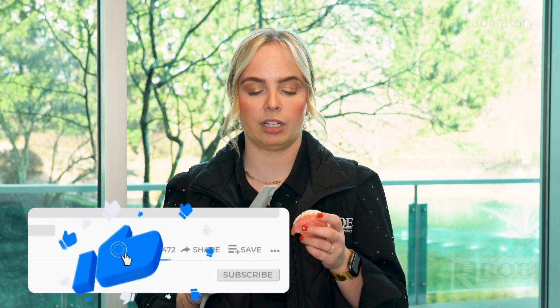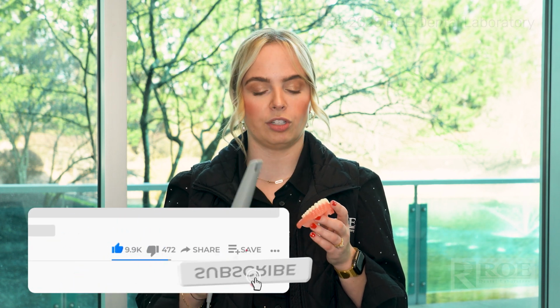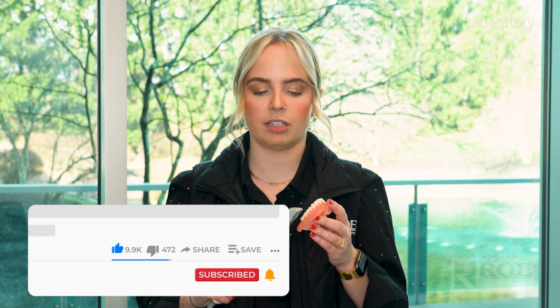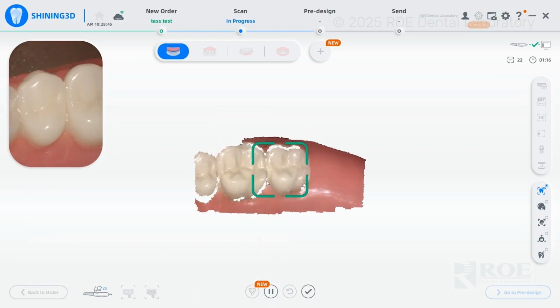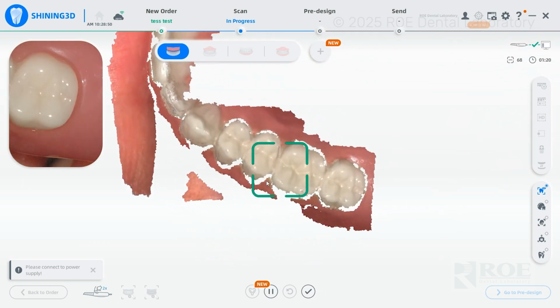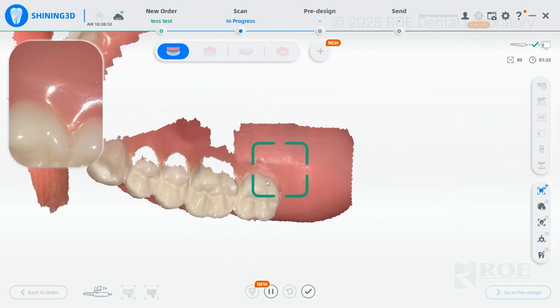The first piece of information we're going to need is a 360 scan of your patient's denture. You can go ahead and utilize your iOS for this scan and start on the tooth surface. We're going to scan the full arch all the way across, capturing all the teeth and starting to capture some of the acrylic on the denture itself.